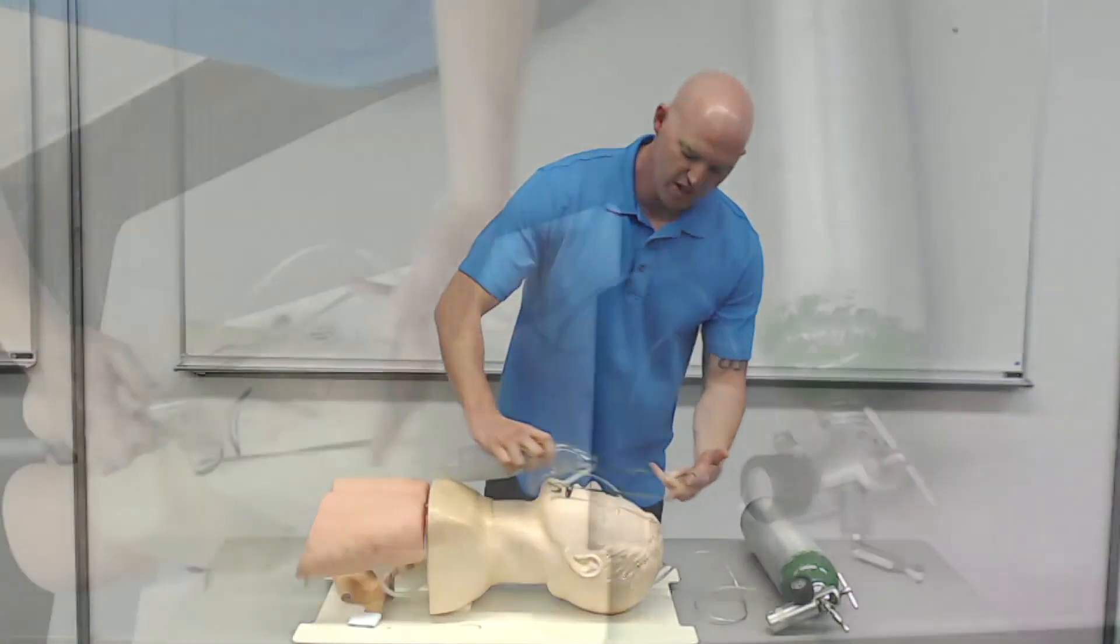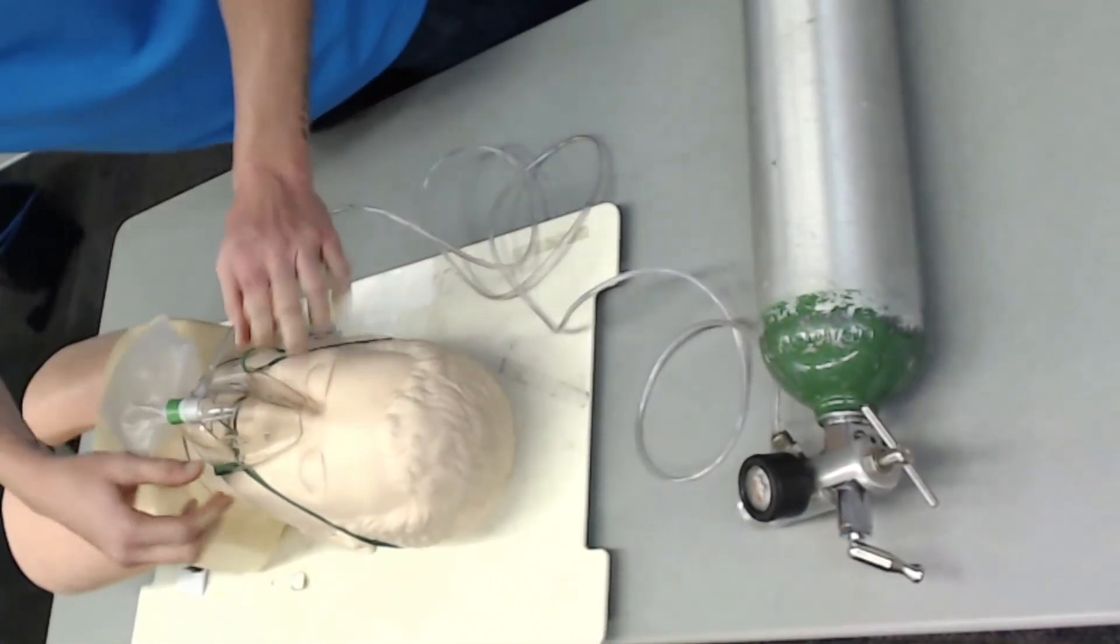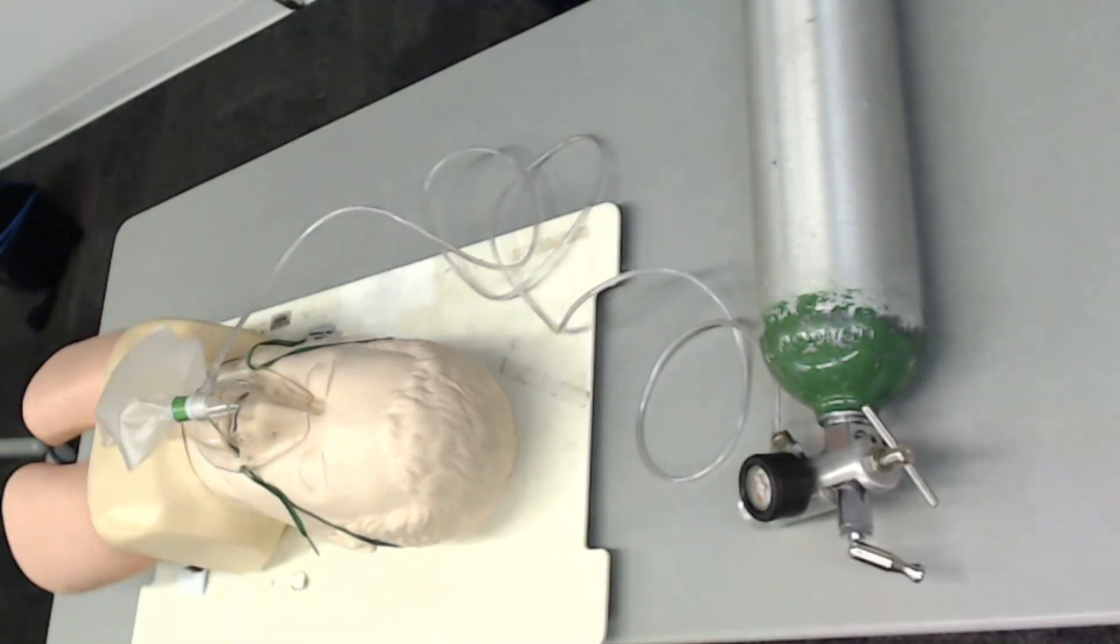I'm going to apply the O2 to my patient. At the very end I'll cinch it tight and I'm done.